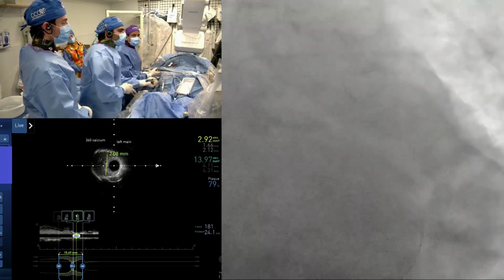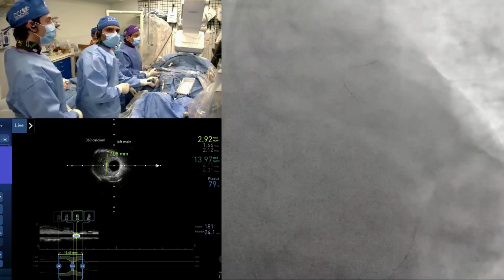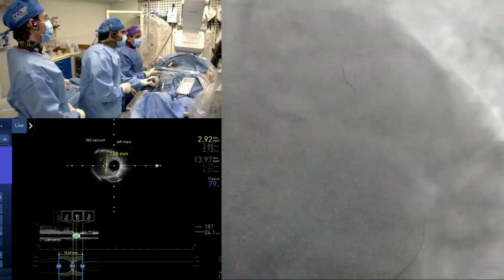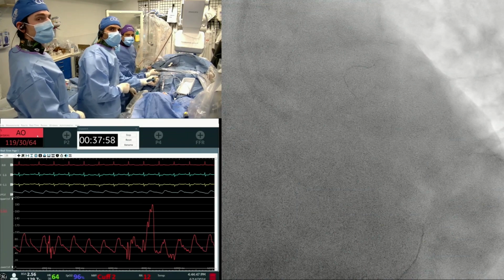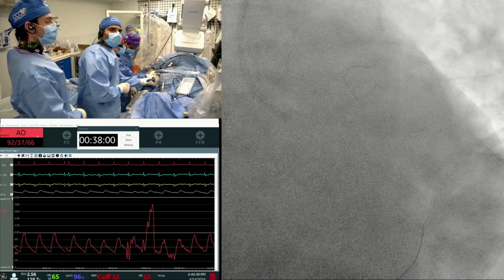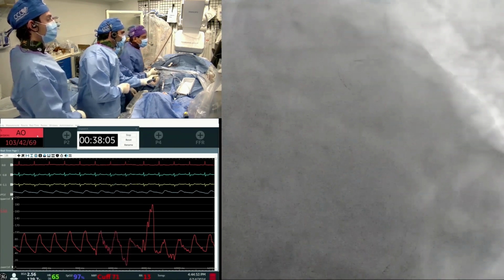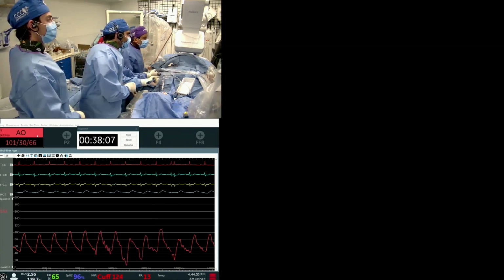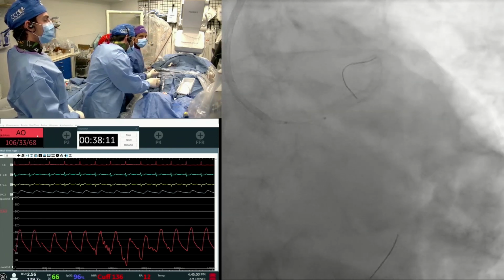So blood pressure, tell them to show the hemodynamics. But are you across? From blood pressure goes down. Remember we talked about... Are you across the bifurcation? We can't see here. He's doing the ostium. We can't even see without cine. Okay, we are going to do it again. Now, Steve, go up. I think you're across now.